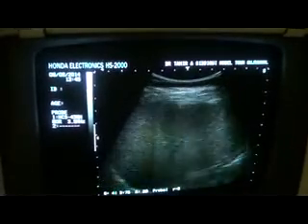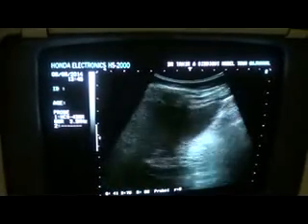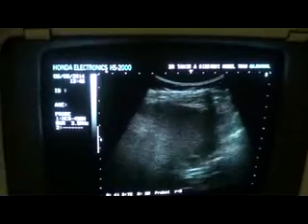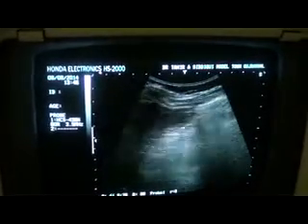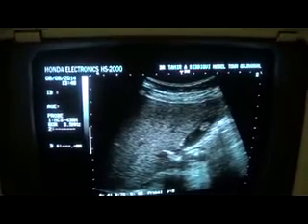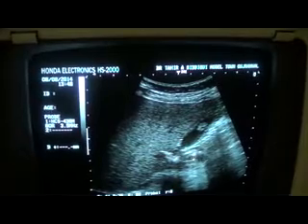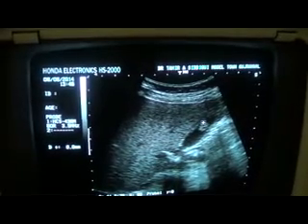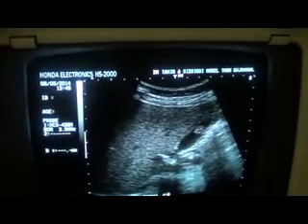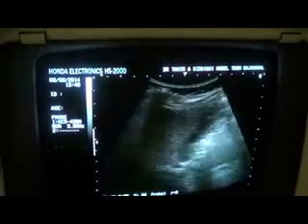Now, what is the benefit of changing the position of the patient? The patient is positioned accordingly. I have asked the patient to take a deep breath and hold it. Now, this is the gallbladder. This is the portal vein and this is the echogenic area, measuring approximately 7.6 by 7.6 mm — it is a globular one, and it is fixed right with the GB wall.